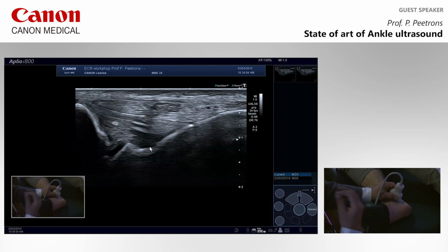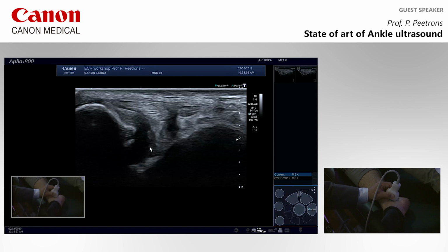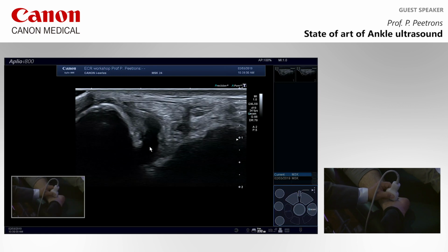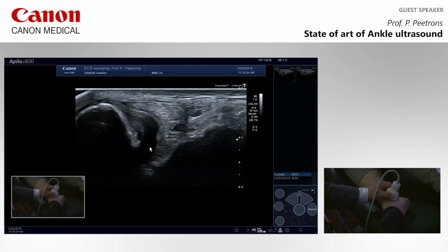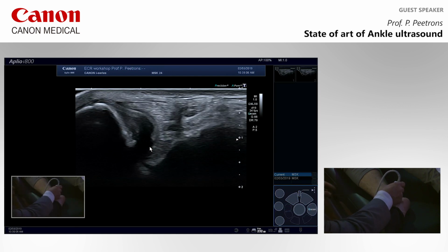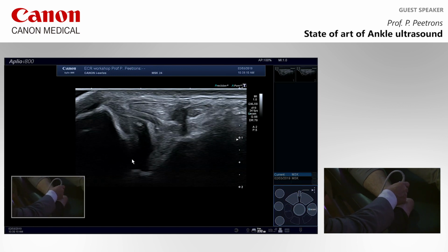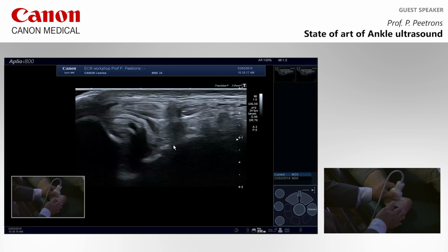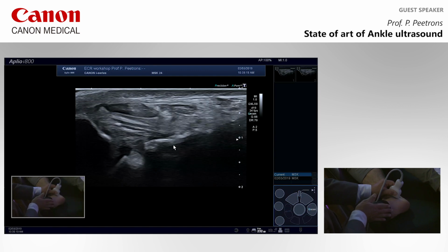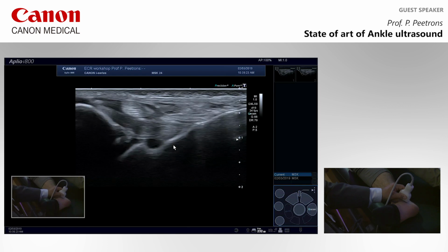You have to think before doing your ultrasound. If you do like this, you'll say, oh, this patient has a stump here on the deltoid ligament. The deltoid ligament is not going to the talus. In fact, the deltoid ligament is doing like this. It's coming here, going there, and going here. Okay? And when you open the gate, open the gap, you see exactly what I told you. The deltoid ligament is normal.